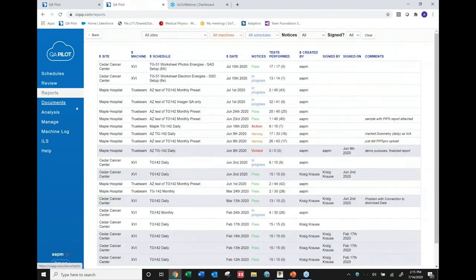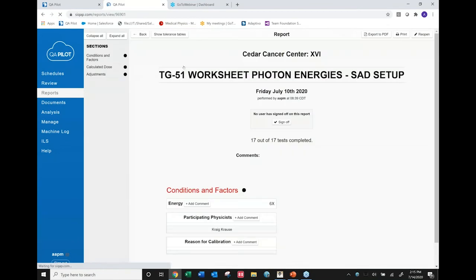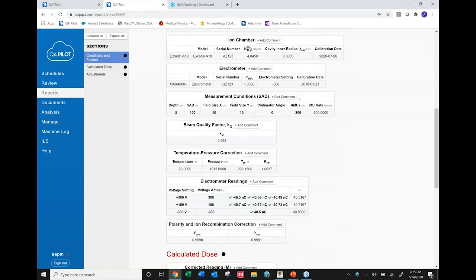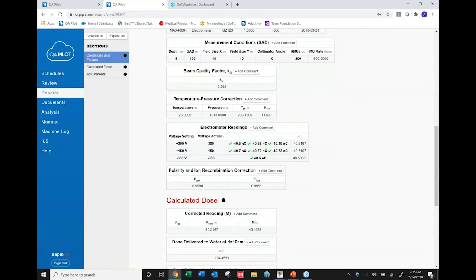And one thing I just wanted to show you very quickly. So for example, here, the very first one is one of those TG51 worksheets. You set up a lot of the information under the equipment, what type of electrometer, ion chamber do they apply to TG51. If it's your chamber, you're setting up diameter, materials, those types of things. On the Linac level, you're setting up your energies and are you using SSD or SAD. And then you basically have these worksheets. Some of this information automatically pulls in when you select your detector of choice, your electrometer of choice. It certainly fills in information on your SAD field size that you set up under the machine. Your temperature and pressure, of course, you're taking that yourself.